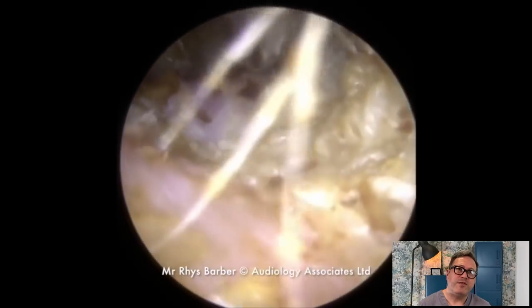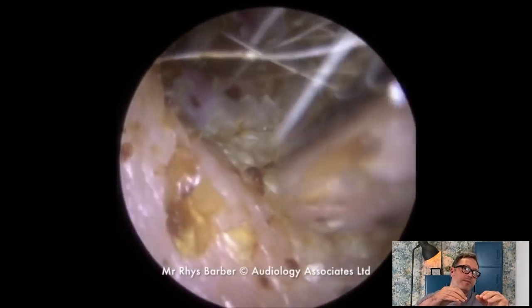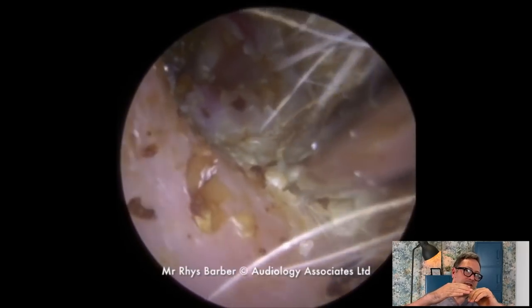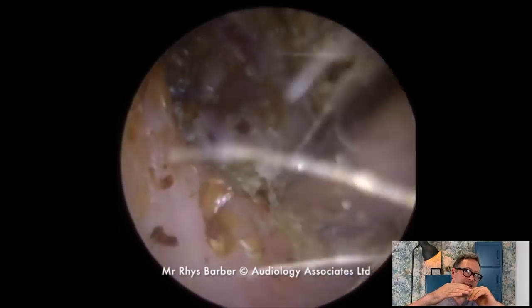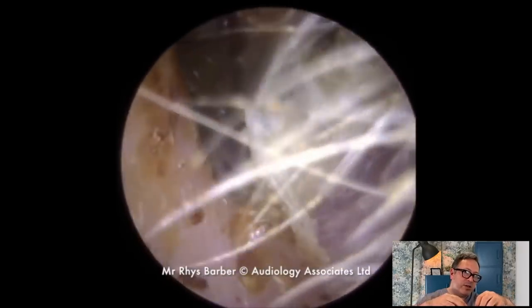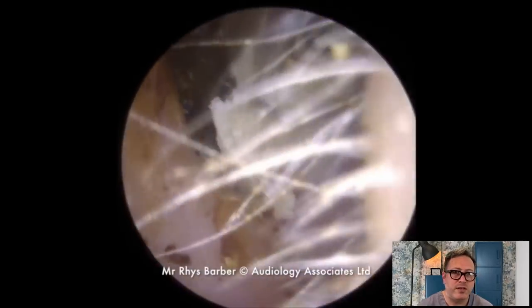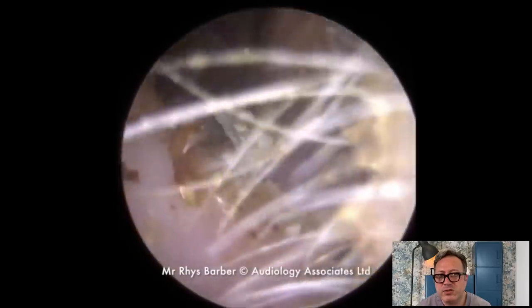You've got to be careful. Don't forget we talked about the degradation to the canal wall. When you see these whiter pieces at the bottom — we covered it in the last video — sometimes when you start lifting this up, you really do run the risk of some bleeding under there. Also, this dead skin could be eating down through that canal wall skin and down to the actual bone underneath sometimes.